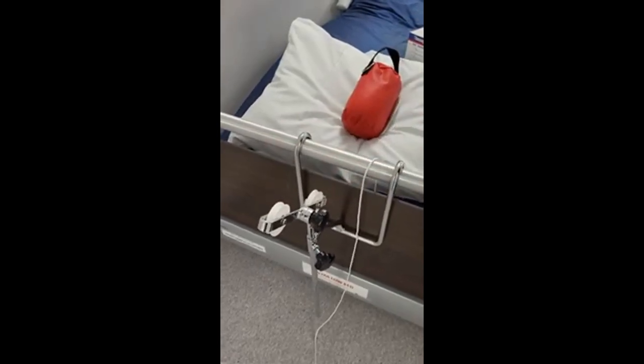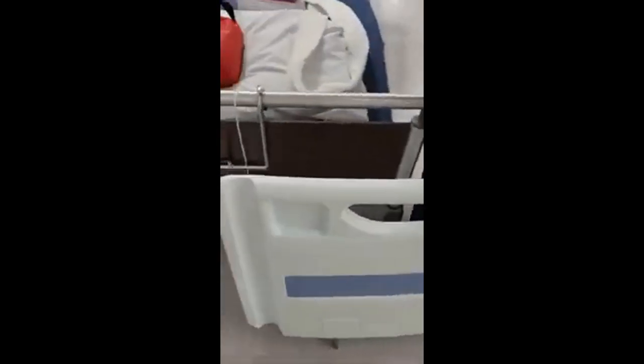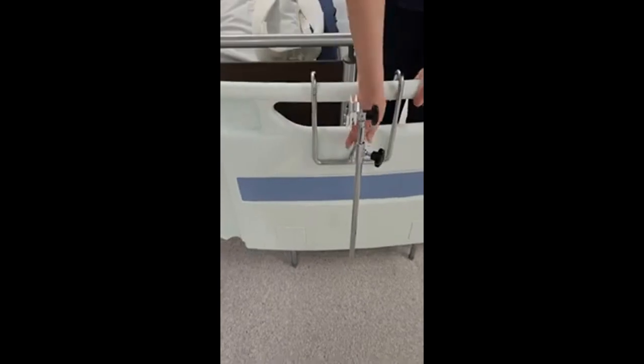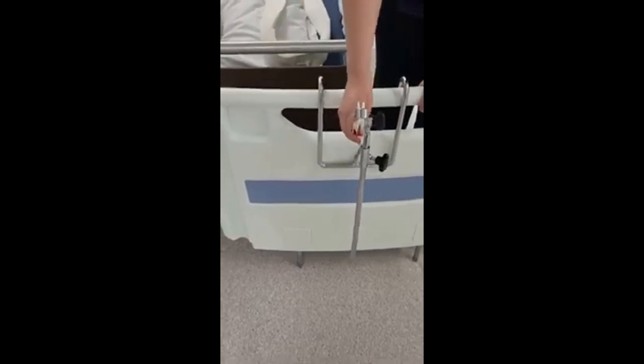If you're using a paediatric bed and your patient is less than 40 kilos, these are plastic ends and the swan's neck just fits over the end like so. But if the child is greater than 40 kilos, this end of the bed is not strong enough to hold the weight, so we would need to get the adult bed.